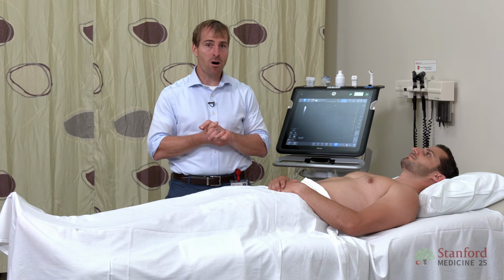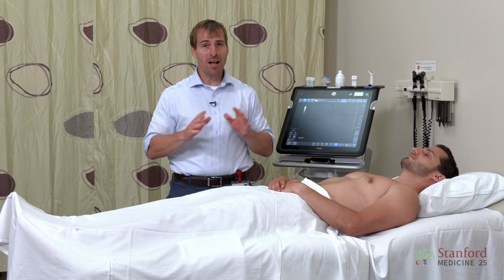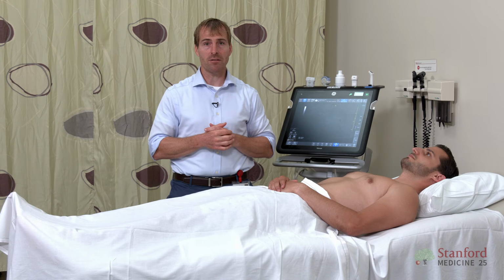Now, I'm still going to recommend to all of you that the IVC is one piece of data, and it's a great piece of data, but it's not the only thing that you should rely on. But let's make sure you know how to get a good picture of the IVC.